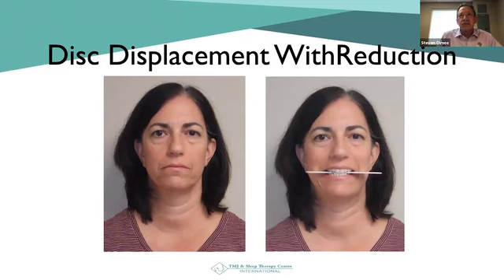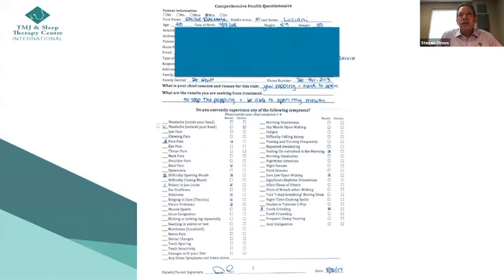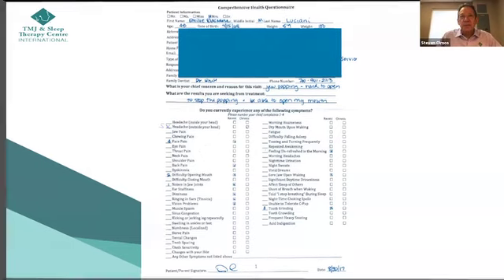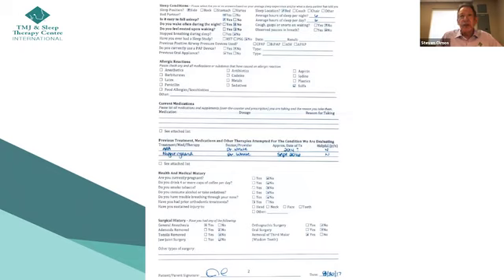So here's a patient with disc displacement with reduction, and that's her primary chief complaint. Her chief concern and reason for that visit was jaw popping and the difficulty in opening. She really wants to stop that displacement. So I explained to her that she has a dislocated jaw, and when she opens her mouth, the disc pops back into place. And I said, you know, this is going to continue, and someday, who knows, maybe it'll be completely displaced without reduction. You can see that she's had various night guards and anterior repositioning appliances, but with no resolution of the problem.